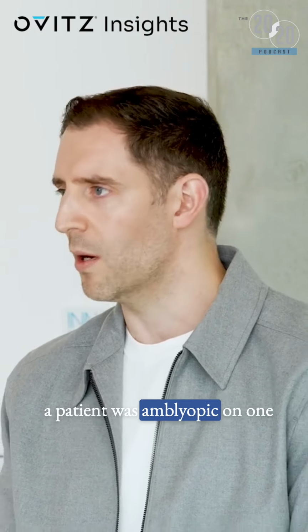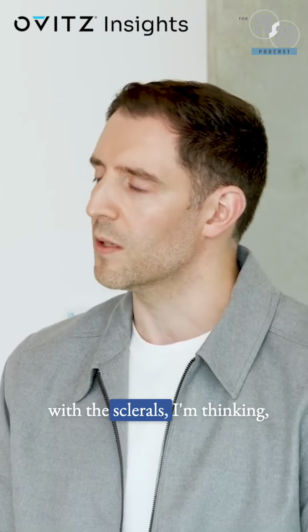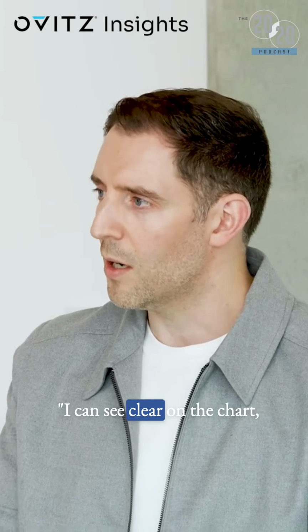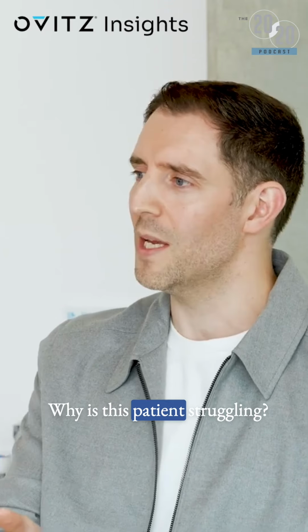I think of a specific case where a patient was amblyopic in one eye, had keratoconus in both, struggling obviously with his vision as the keratoconus had progressed. And so coming in, fitting him with the scleral, I'm thinking, this patient's going to love it. This is going to be a slam dunk. Well, his exact words were, I can see clear on the chart, but the glare is worse. And I thought, no way, right? This just doesn't make sense. Why is this patient struggling?